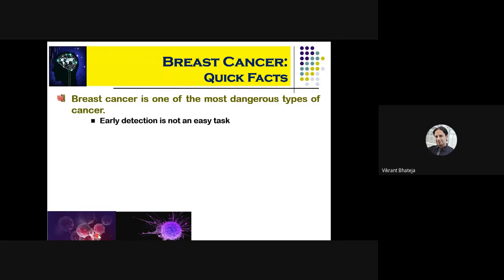So in the first image, the tumorous or cancer cells are in the very initiating stages. They may be present over there, but they may not be very dangerous. But once you see that there are some emerging spiculations or radiating lines from the boundary of this particular cell, you see that this cell has now become active. Now, this is projected to be dangerous, as this particular cell has started affecting other cells.